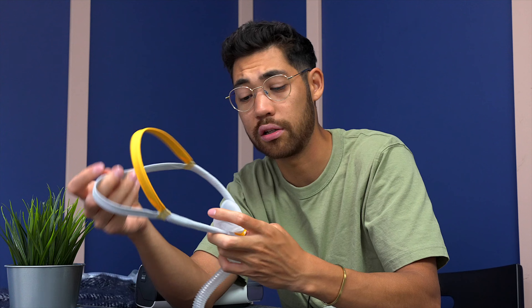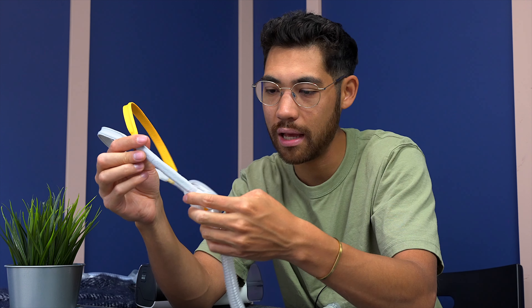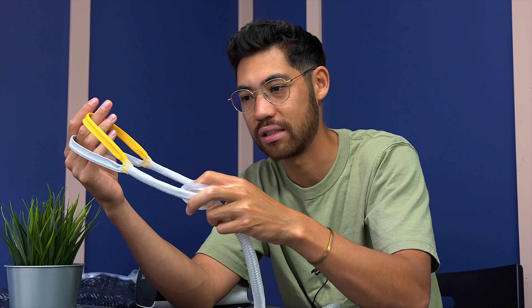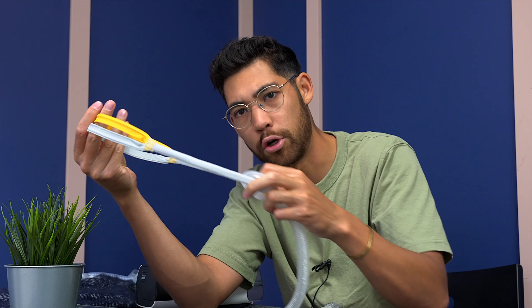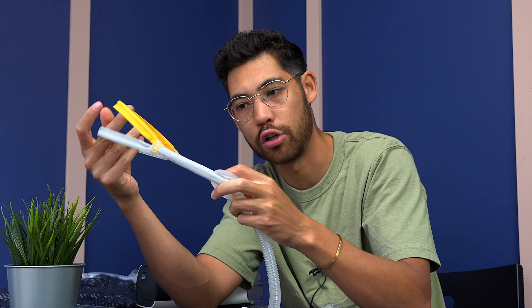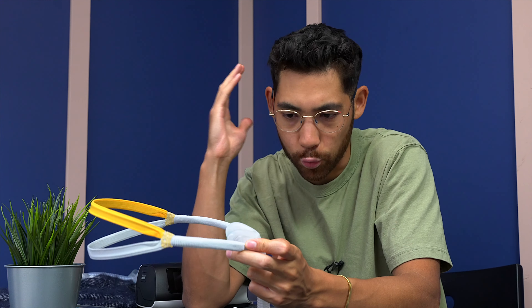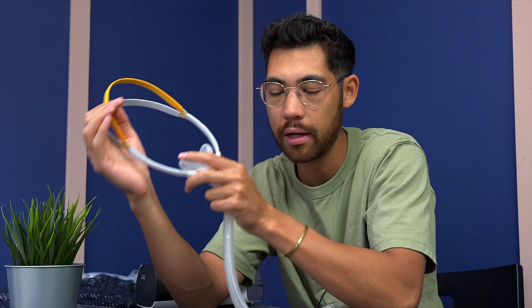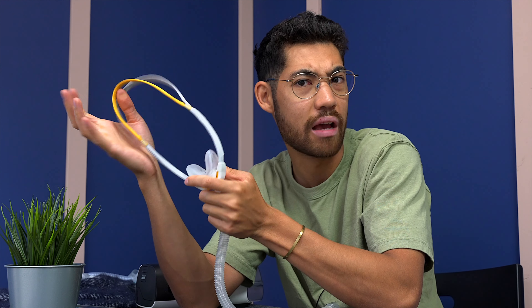Because it's stiff, it's a little bit more stable on your face. The front of the headgear has a seatbelt design. As you move it back and forth, there are two latches that go back and forth and kind of lock into place — kind of like a seatbelt that jams when you pull it too fast and only feeds back in but can't be pulled back out. As you push it in, it has more tension, it's hard to pull back out. If you push it into your nose, it almost locks in place. I think pretty much everyone can agree that the Solo headgear is one of the best headgears ever made for a seatbelt-style mask.